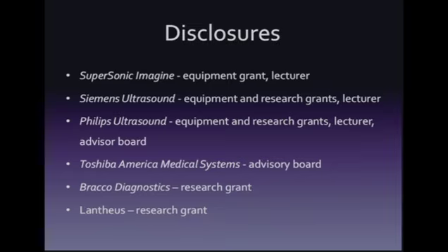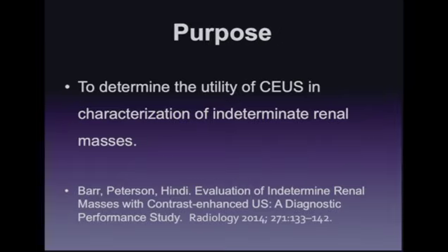These are my disclosures. The purpose of our study was to determine the utility of contrast-enhanced ultrasound in characterization of indeterminate renal masses. This study has been published in Radiology in 2014, as listed on this slide.